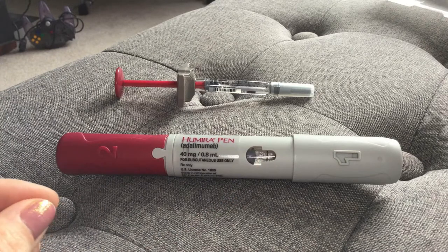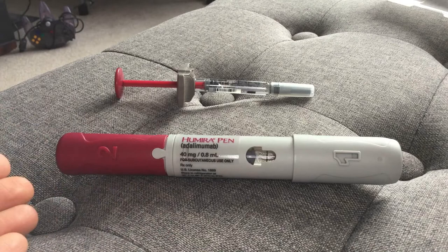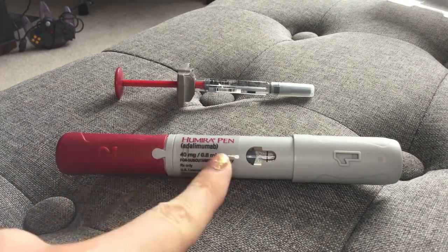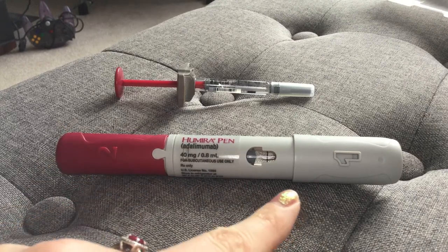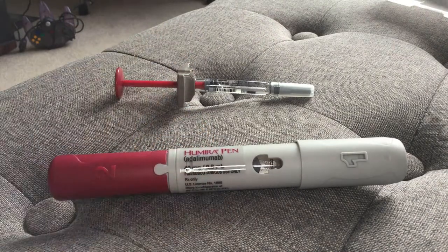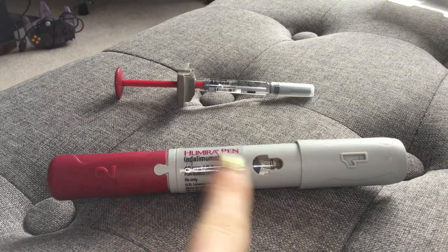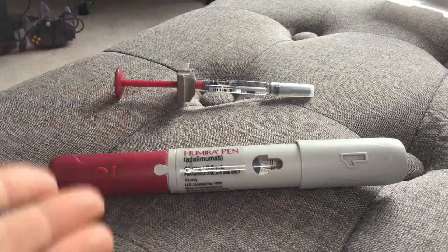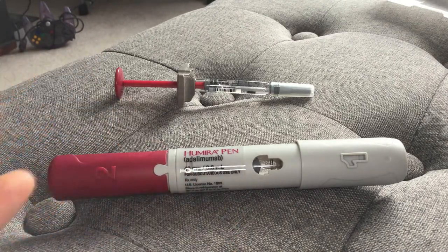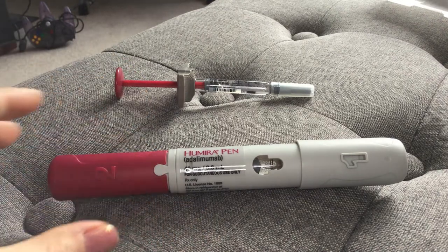A high-powered spring is activated once you hit the button and it shoots it into you — it works the same way as a finger-pricker for checking blood levels if you're diabetic. The only positive I'd say about this is that you can't see the needle. You really can't see any of the mechanics, so if you're a visual person or visually scared by needles, this is probably the best bet because you don't see any needles and you don't see what happens.